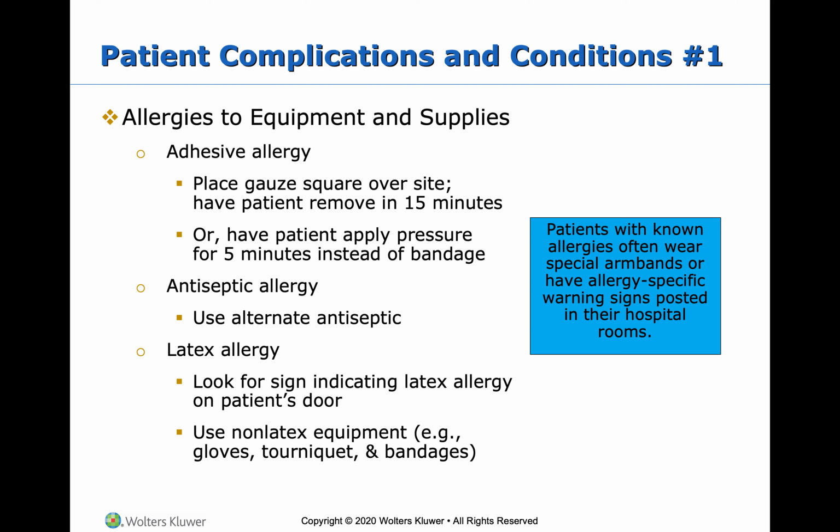If they don't want a bandage, I always stand and hold pressure on the site until it stops bleeding, and then I still have them hold pressure after I leave. So I will hold pressure until it stops bleeding, and then I will say, if you don't want a bandage, hold pressure on this for another 5 minutes. That's usually sufficient if the patient is willing and able.